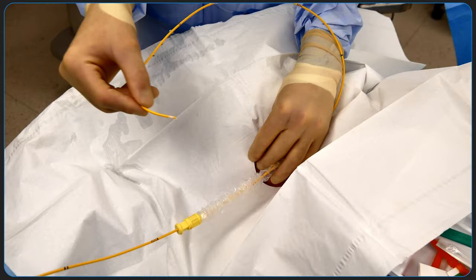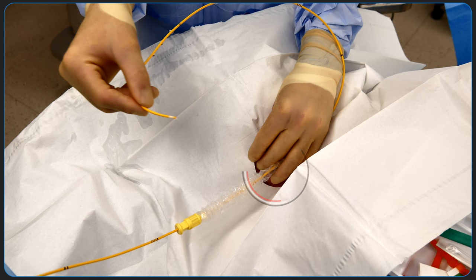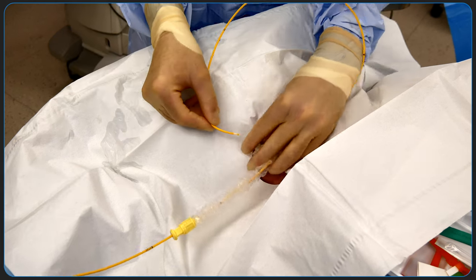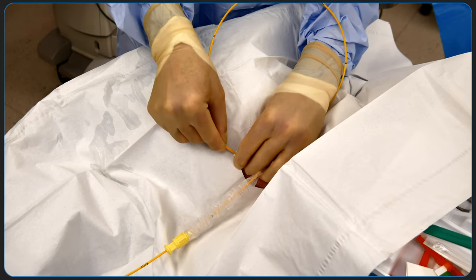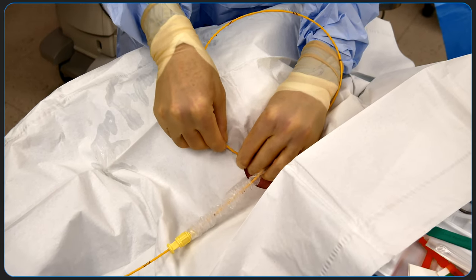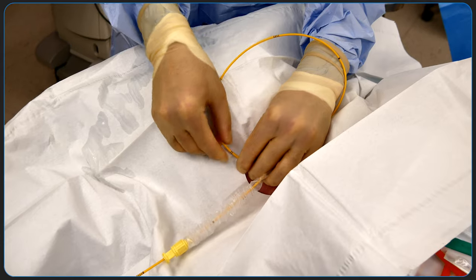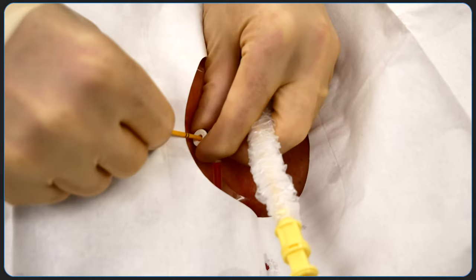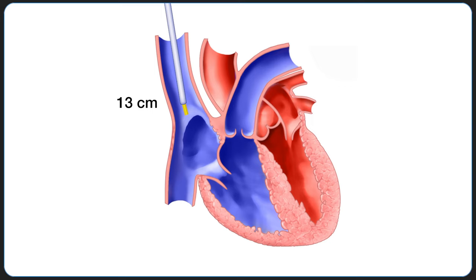We will now demonstrate floating a PA line through a PSI catheter. A secondary fenestrated drape overlies the hub of the PSI catheter. After the PA line is flushed and checked appropriately, ensuring the plastic sheath is in place and locked at 80 cm, the PA line is placed into the hub of the catheter. It is introduced with the tip pointing to the patient's left shoulder and advanced to approximately 20 cm with the balloon deflated. It is important to recognize that the catheter emerges at 13 cm.